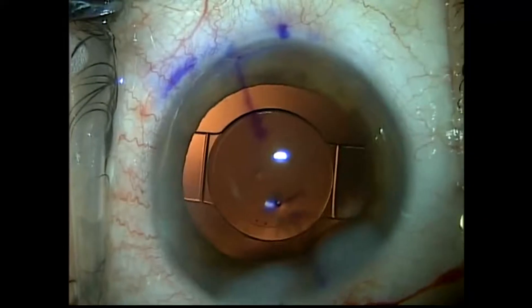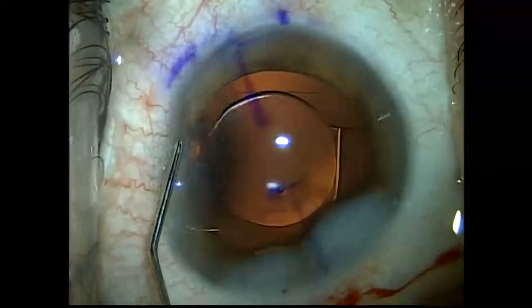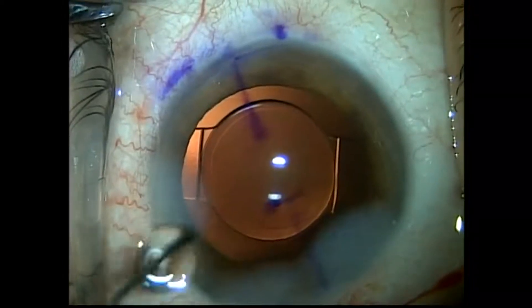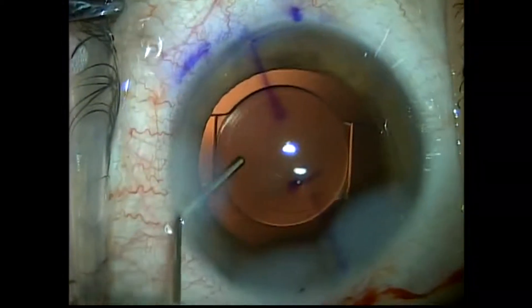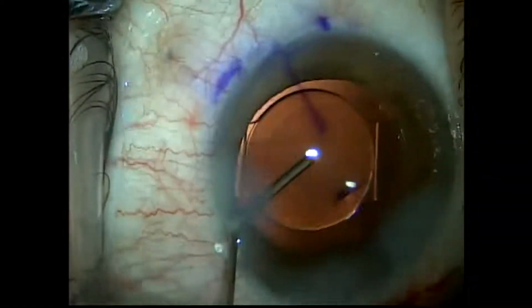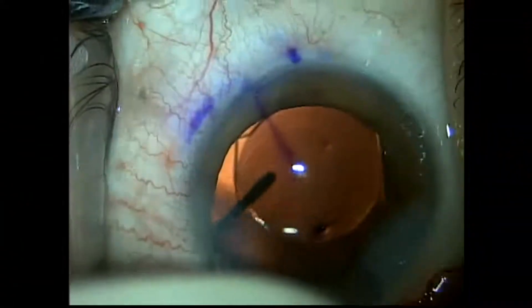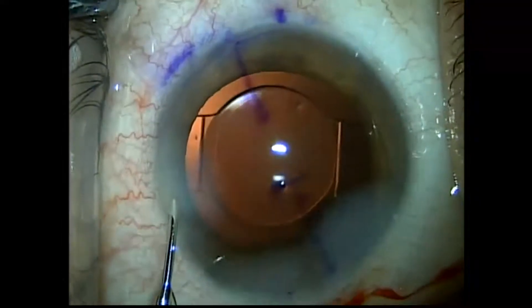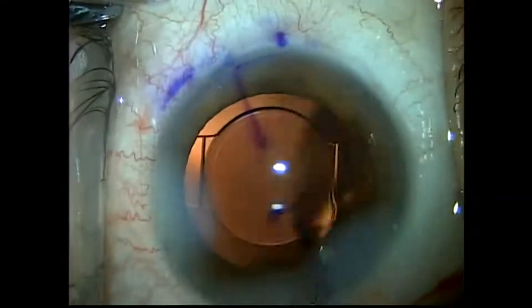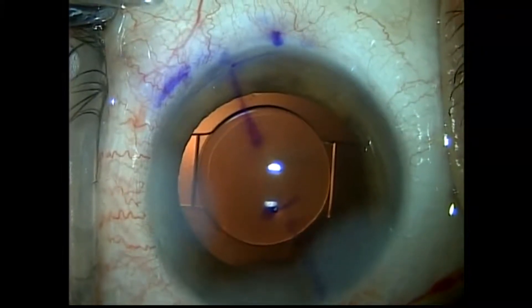I stromal hydrate my paracentesis port and double check the position of the IOL. I rock the lens back and forth — top haptic, bottom haptic — just to make sure the haptics settle at the equator of the bag and don't grab the bag prematurely, which could create a potential future Z or Y syndrome.